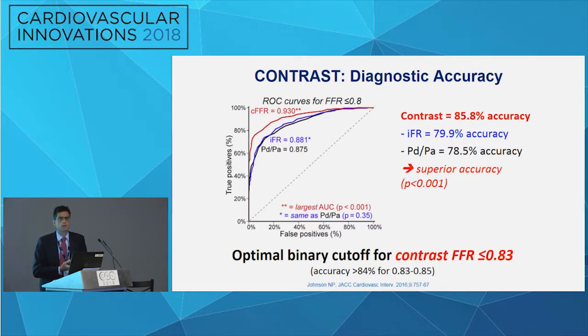So you're still clearing the catheter with saline and everything else? Clearing the catheter with saline, taking a picture, flushing, 1, 2, record, and record as you do any other adenosine FFR with bolus. I must say, in our lab, we have this problem in which adenosine can only be mixed by pharmacy, IV adenosine.